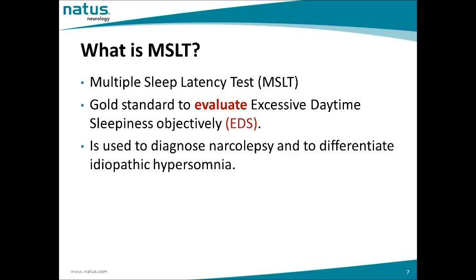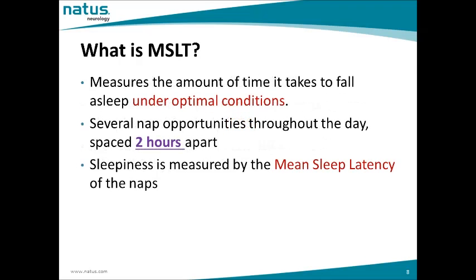Okay, let's start off here. What is MSLT? MSLT stands for Multiple Sleep Latency Test. It is a gold standard to evaluate excessive daytime sleepiness objectively. MSLT is also used to diagnose narcolepsy and to differentiate idiopathic hypersomnia. MSLT measures the amount of time it takes to fall asleep under optimal conditions. There are several nap opportunities throughout the day, spaced 2 hours apart from each nap. Sleepiness is measured by the mean sleep latency of the naps.